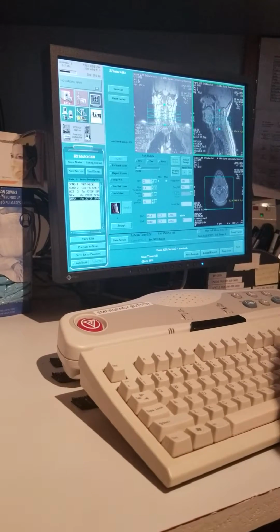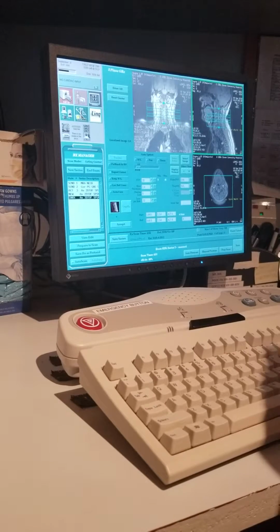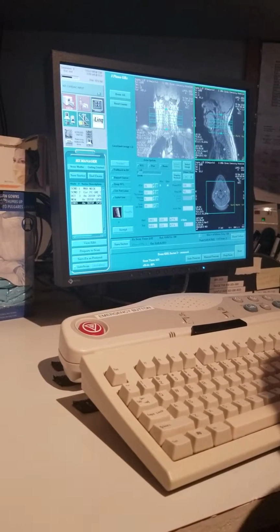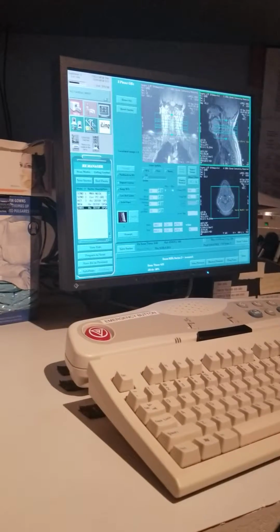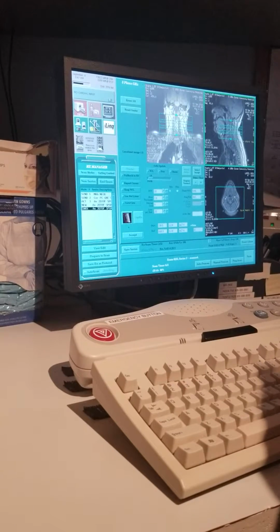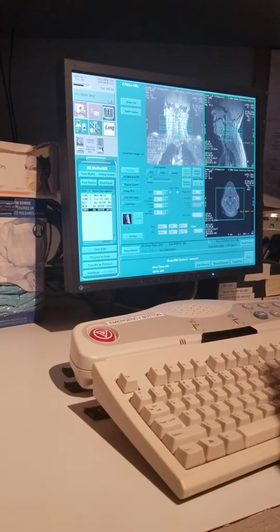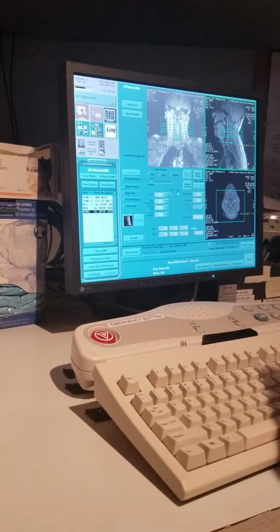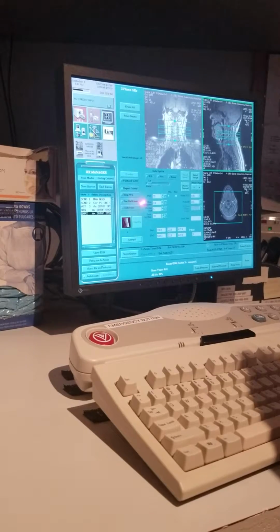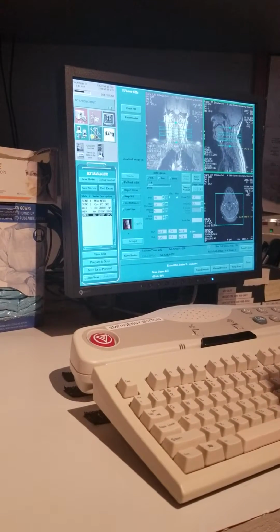There you go. Now we're centered at the bifurcation, because that's really what the 3D is. If you go to a site where you do the full 2D time of flight, then you do the 3D just through the bifurcation, if you're not doing contrast. If you're doing contrast, you'll probably just do the... Ours is so crappy with 2D compared. So let's do the SAT again.